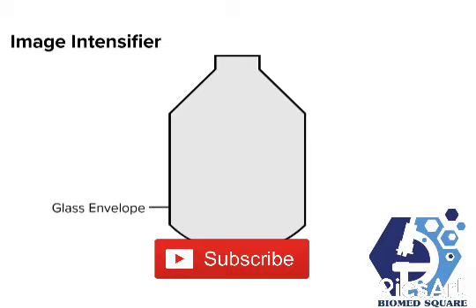First, the whole image intensifier is about 9 inches long and is encased in glass. Within the glass, voltage can reach up to 25,000. Second, the input phosphor acts as a scintillation layer, which converts X-rays into light.